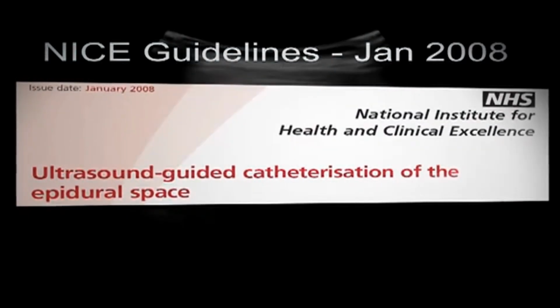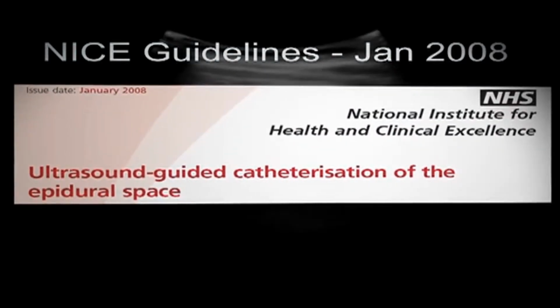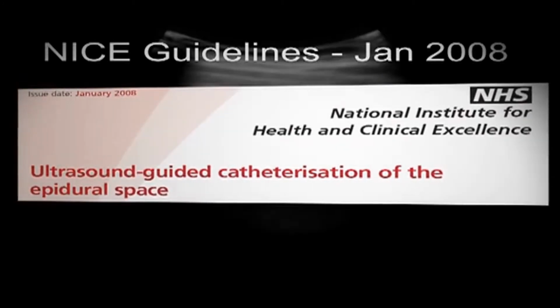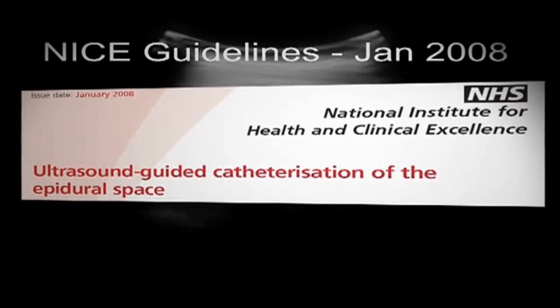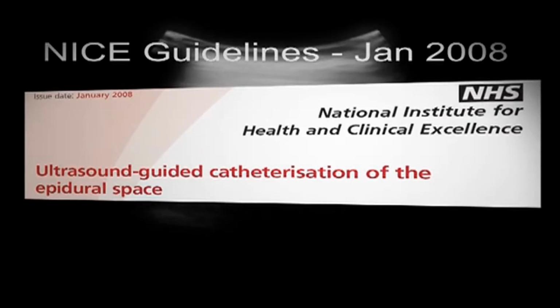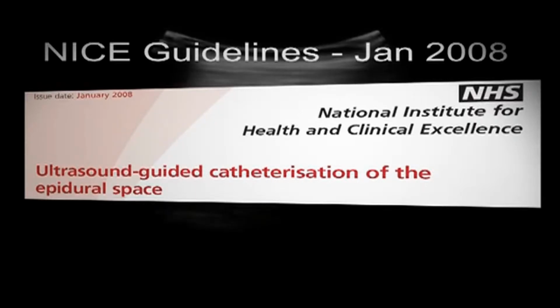In 2008, NICE released interventional procedure guidance for ultrasound catheterization of the epidural space. It recommended that ultrasound was safe and may be helpful in achieving correct placement. There is an increasing incidence of obesity in the obstetric population. This makes identification of the epidural space by a landmark technique alone more problematic. Ultrasound may increase the likelihood of success in these patients who arguably have the most to gain from successful neuroaxial analgesia and anesthesia.